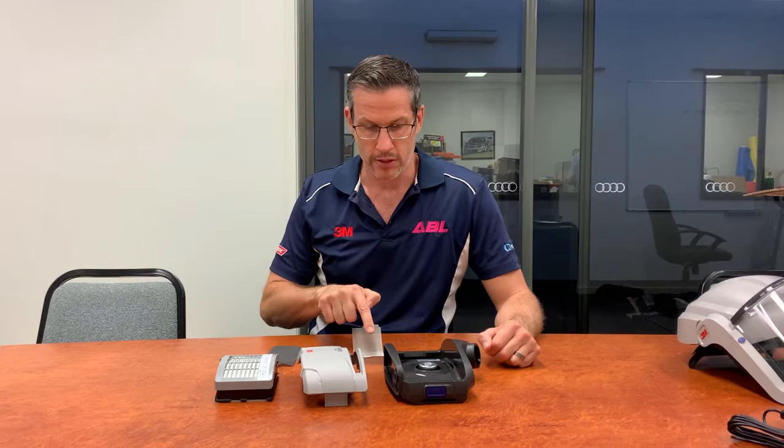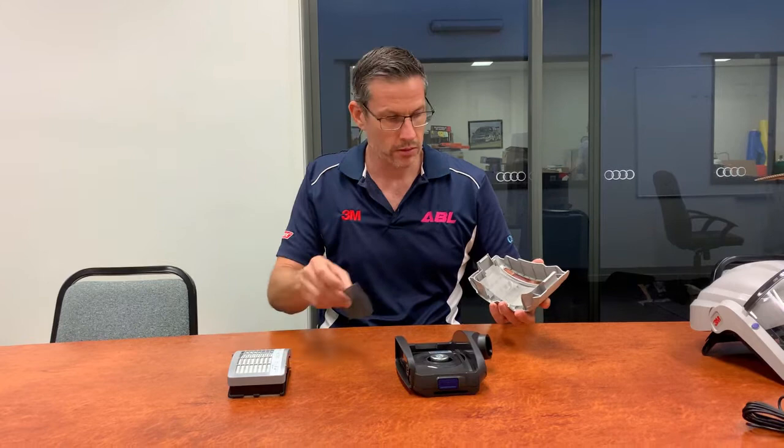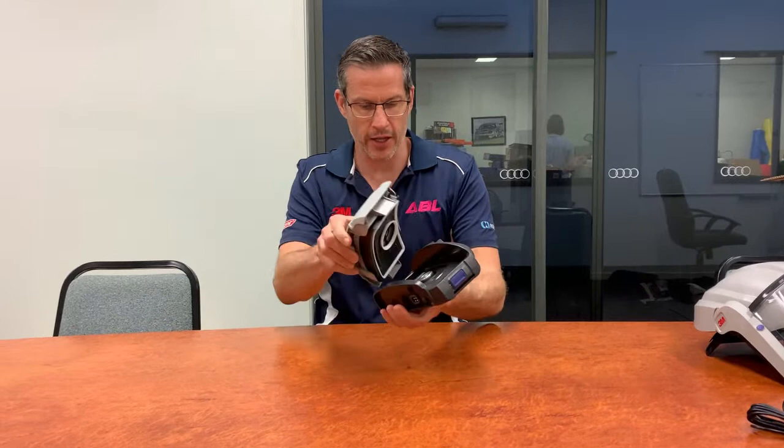Here we have the Versaflow power unit TR-300: the housing, P3 filter, pre-filter, and a spark arrester. Simply take the housing, place in the spark arrester like so, then the pre-filter, and then the P3 filter itself. Then attach the housing to the unit and you'll hear a click when it's secure.